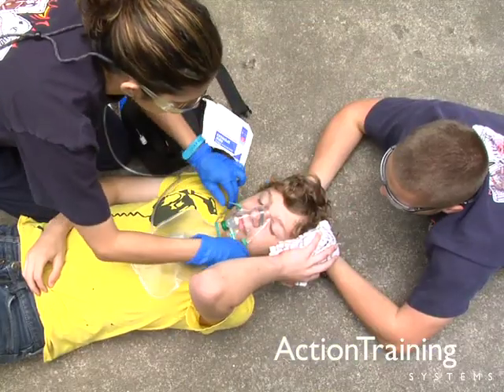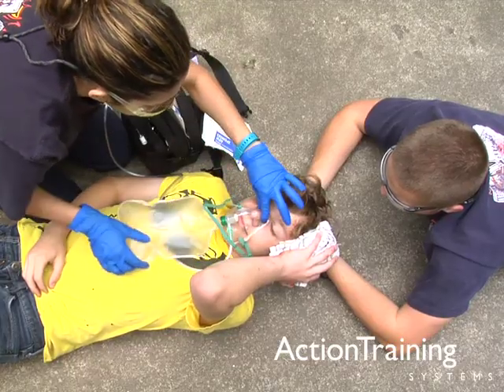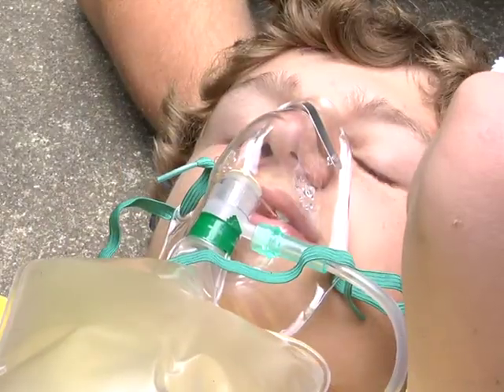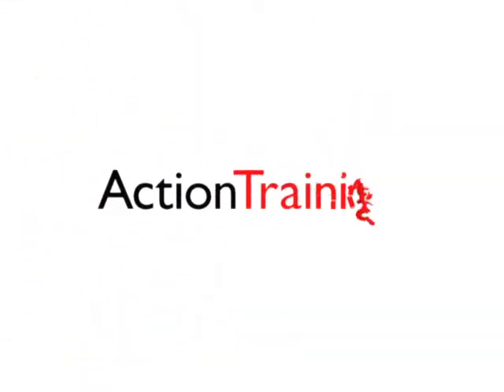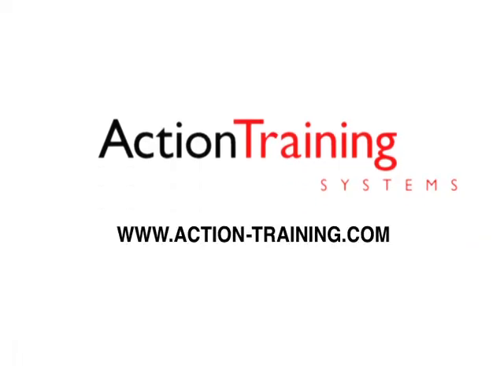Your ability to quickly assess a patient's breathing and administer emergency oxygen can quickly supply the life-giving aid that a compromised patient requires.